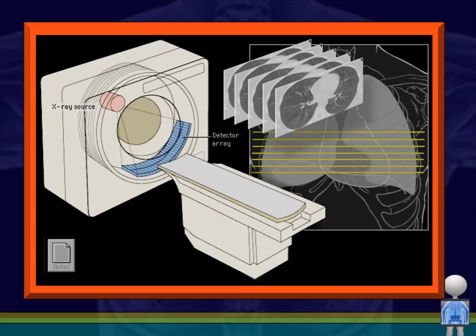A regular X-ray gives you a two-dimensional picture of what you have, and it can't really define on the picture things that are in front or in back of each other. It can show you a little bit of location change, like we talked about using a lateral film versus a frontal film. But this is a way in which we can literally slice our person up and then find out what's going on. Of course, I mean that figuratively, slicing them up.